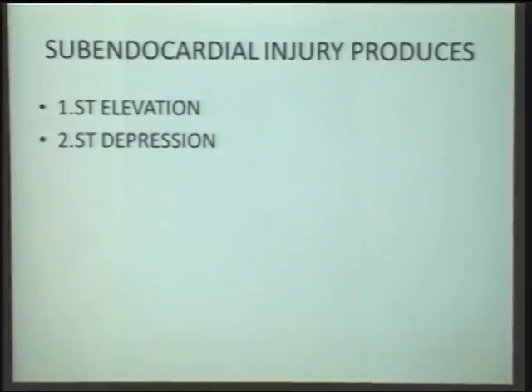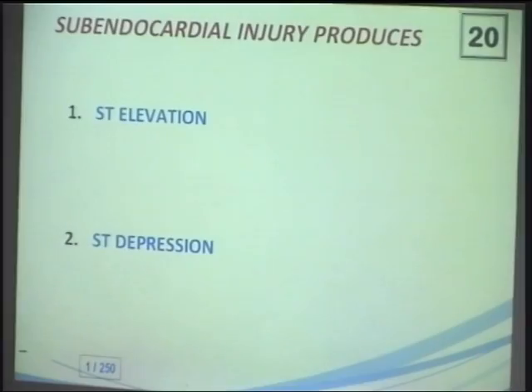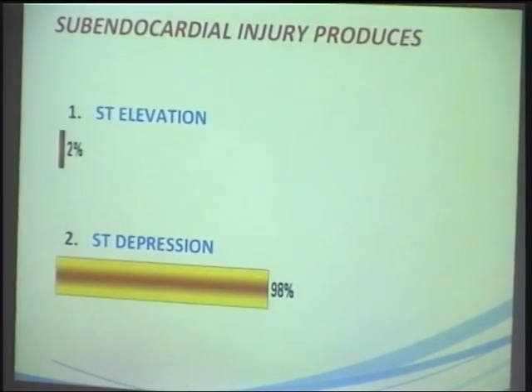Subendocardial injury produces ST depression.